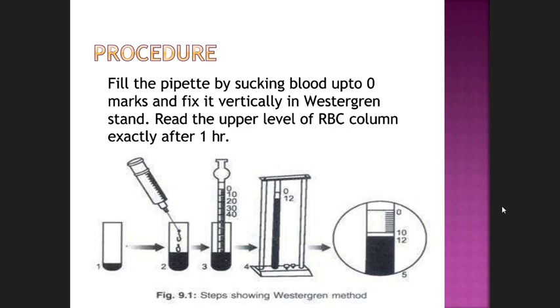Then we put a timer on, and after 1 hour we read how far the upper portion of the blood has fallen. Then we note the reading.